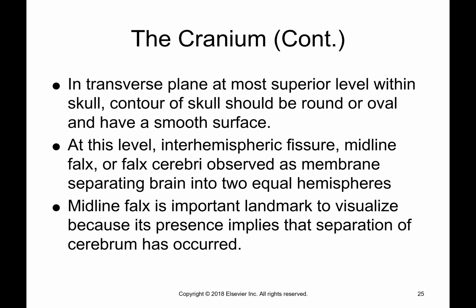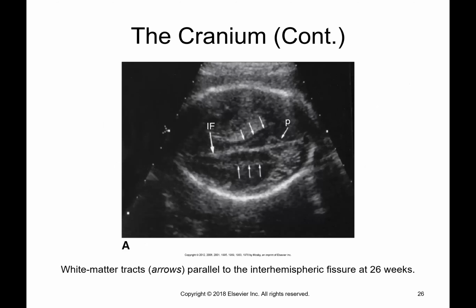In transverse plane, at the most superior level within the skull, the contour of the skull should be round or oval. At this level, you should see the fissure, the midline falx, the falx cerebri, observed as a membrane separating the brain into two equal hemispheres. And the midline falx is an important landmark to visualize because its presence implies that the separation of the cerebrum has occurred. So that's really important. Here it is. You want to see that.